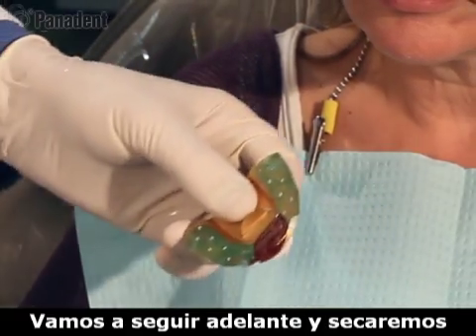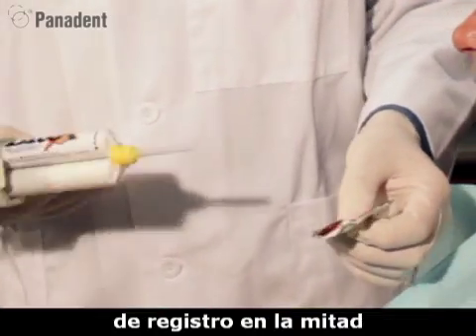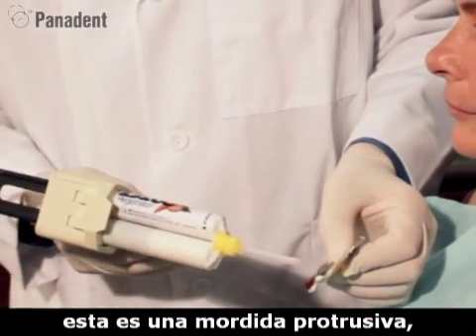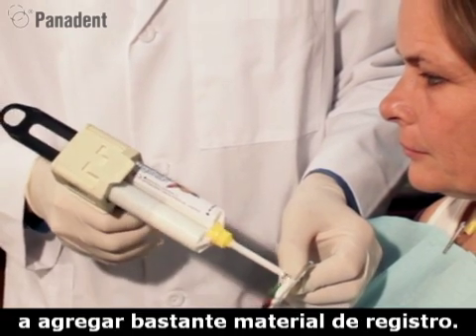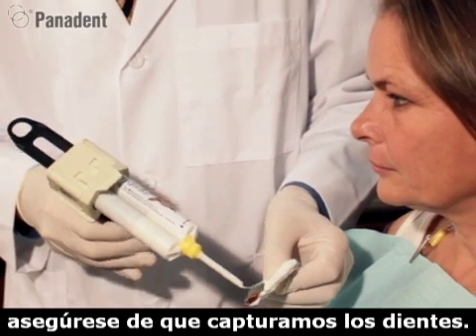We'll go ahead and dry off the lower surface of the bite tray. So we're ready to add our bite registration material to the lower posterior half. Knowing that this is a protrusive check bite, you can have much more space between the posterior teeth. So this time we're going to add quite a bit of bite registration material. Really build it up. Want to make sure we capture the teeth.